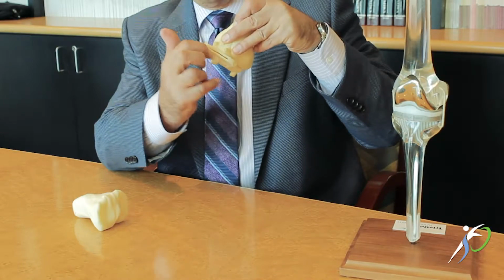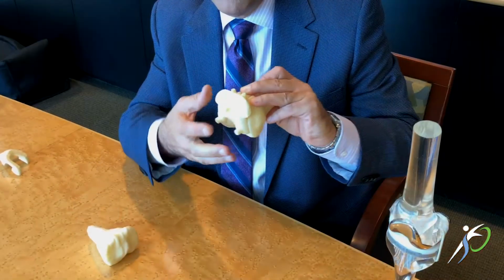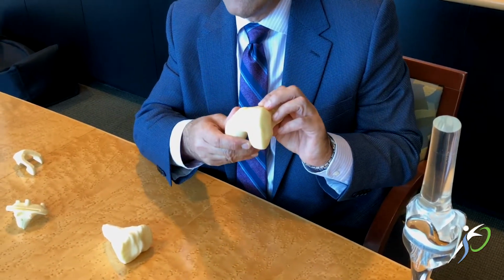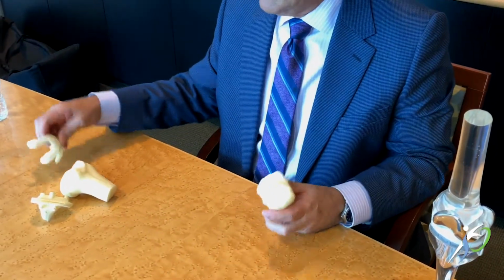a line, there's a space, and the saw blade would be able to go through that and make a cut on the bone, and this would give us the exact cut that we planned preoperatively. That would be the cut for the femur. The tibia has a similar cutting device.